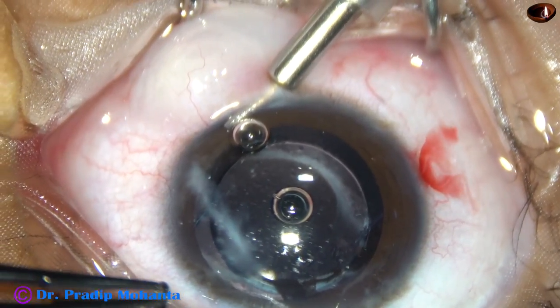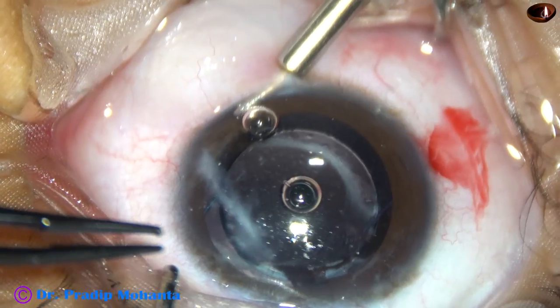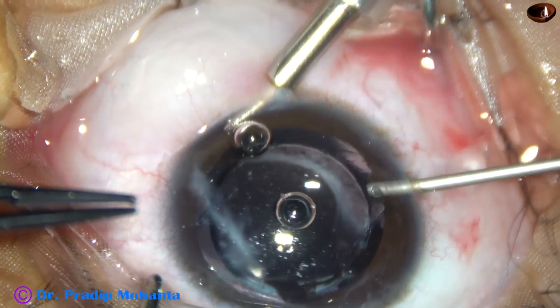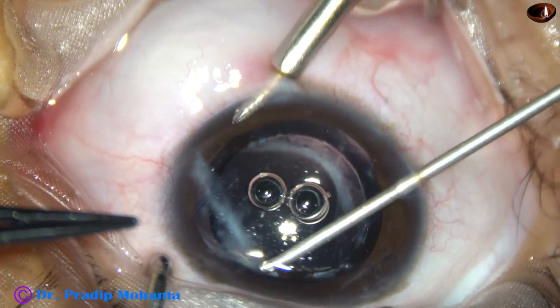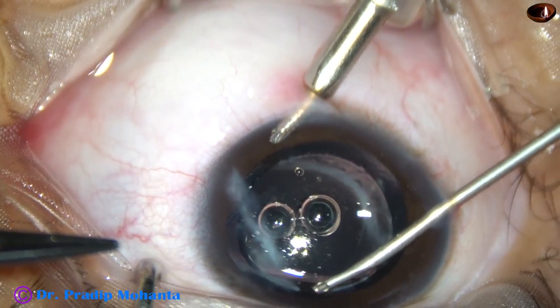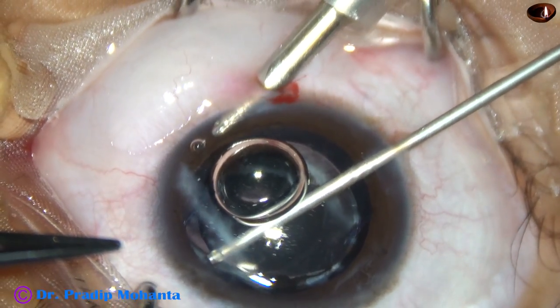Now I am going to introduce a 23 gauge cutter. The machine being used is Faros from Oatly. And here goes the 23 gauge cutter. There is no tissue band here — the tissue band is between 3 o'clock and 4 o'clock. So we are going to see that in a moment.